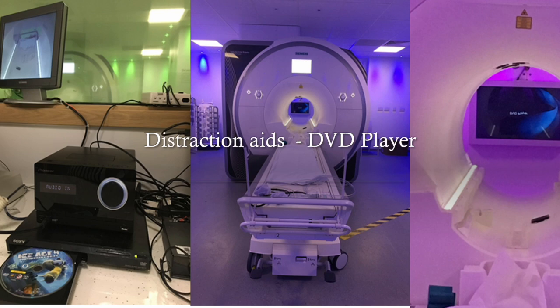And here's our DVD player that we have set up. So we give patients a choice of a DVD, and then the screen is placed on the wall right at the end of the bore. They have the head coil on, or if they're not having their head imaged, we have a separate mirror that goes across, so they can always see the TV, whatever scan they're having. And then the screen comes on. We can switch the direction of the screen, so whichever way up the mirror is, they'll be able to see it in the correct viewing for them, and all the sound gets played through the headphones, so they can watch their favorite movie while they're having a scan.